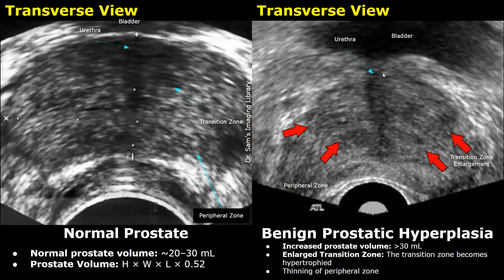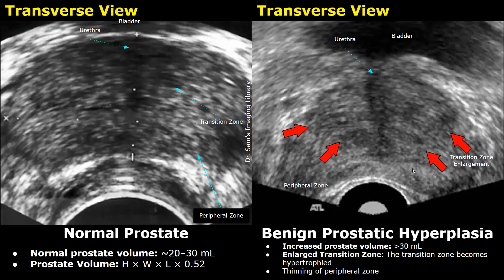This image shows benign prostatic hyperplasia — the prostate is enlarged. You can see an enlarged, hypoechoic, heterogeneous transition zone which is bigger compared to the normal image. This enlargement of the transition zone indicates BPH. Due to the enlargement of the transition zone, there is thinning of the peripheral zone. Overall, the gland will be enlarged and the prostate volume will be greater than 30 milliliters.